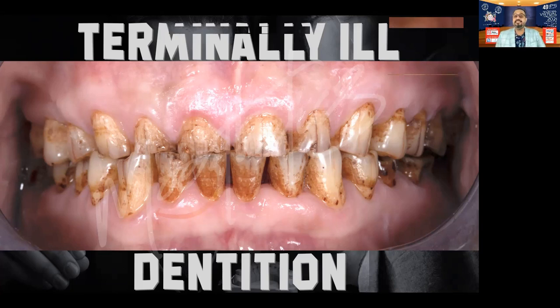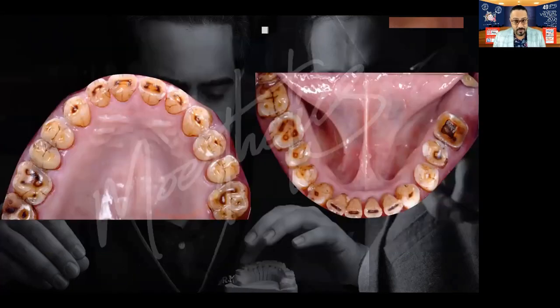They don't break very easily and they don't debond very easily. Yes, lithium disilicate by itself is not very strong. But when you bond it to the underlying tooth, it becomes an extremely strong material to withstand the occlusal forces, even in a case like this.